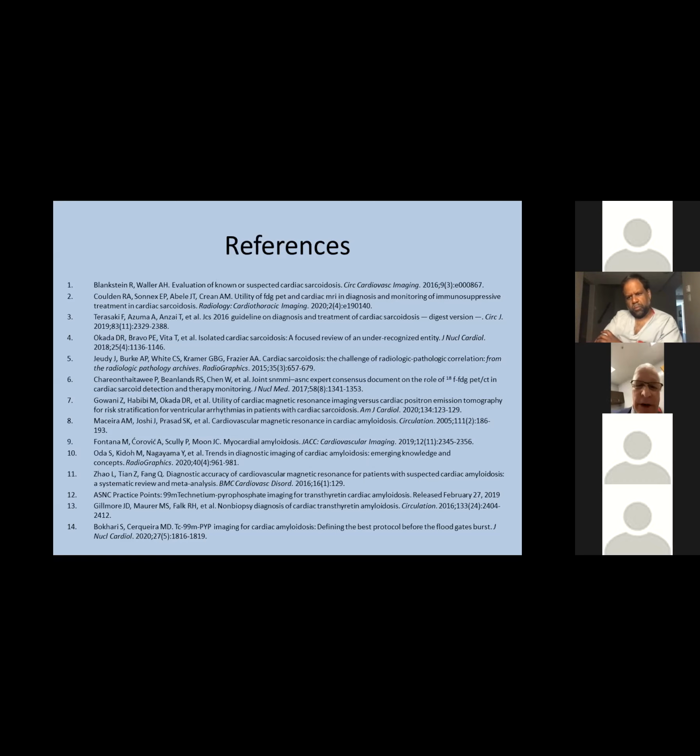But you know how the radiologists get when you say someone's got a can in their chest and you want to send them for MR. Well, yeah, it's a bit more complicated to book them, I guess. There's more coordination involved, but in terms of imaging quality itself, I don't think that it significantly degrades the quality enough that it would affect our interpretation in most cases.